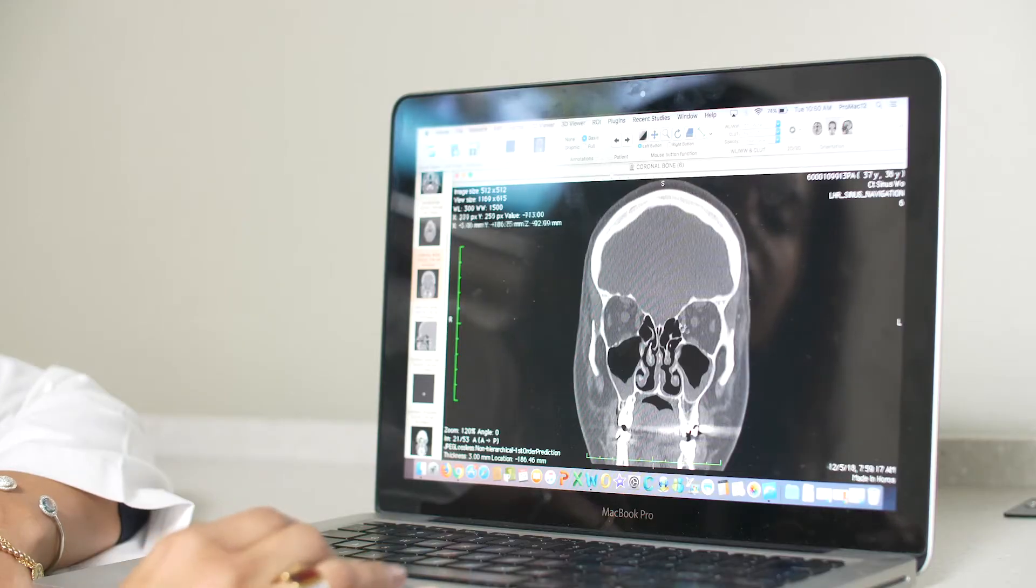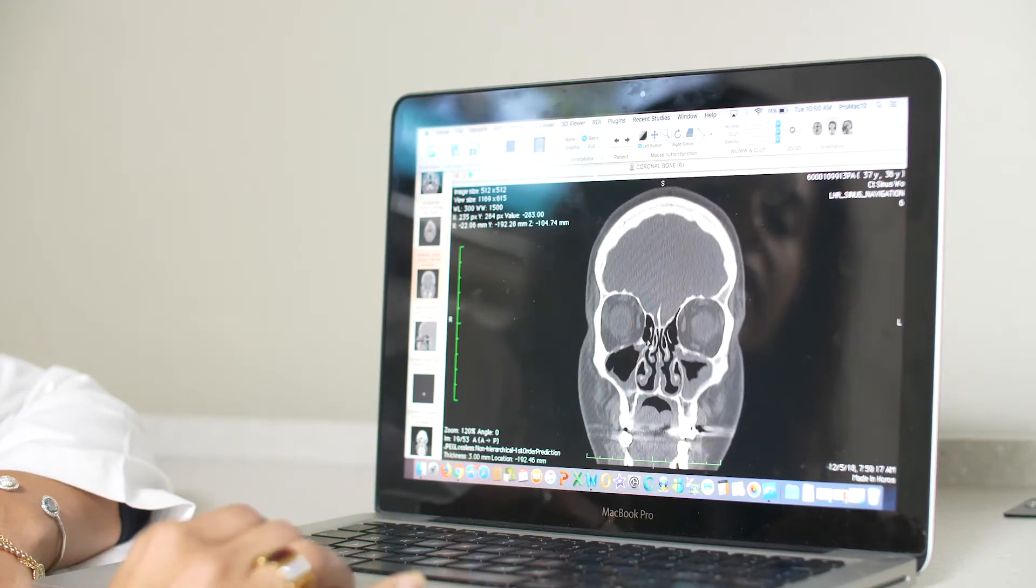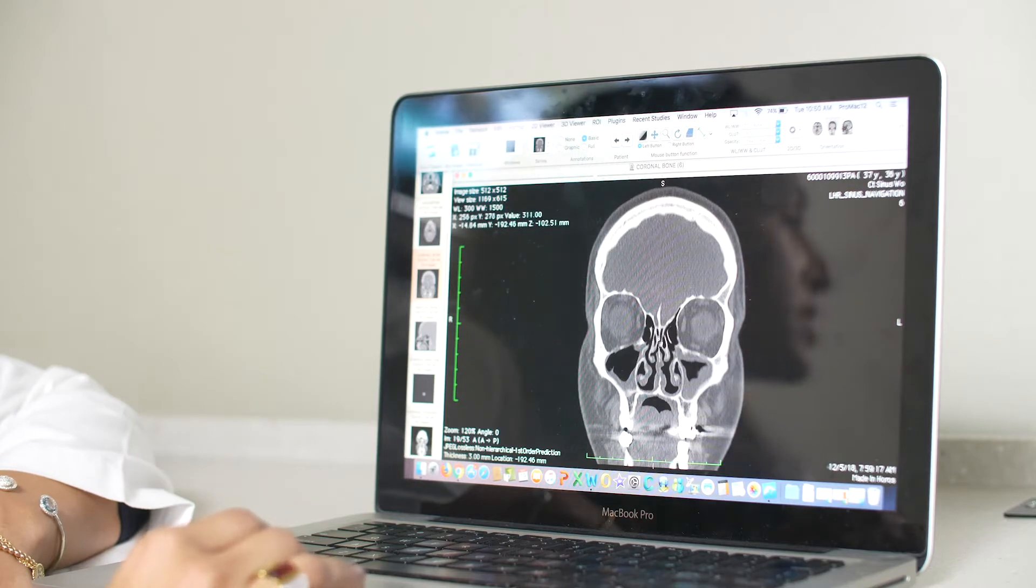Your brain is over here, your eyes are over here. This is the inside of your nose and your septum divides the right and left side of the nasal cavity.